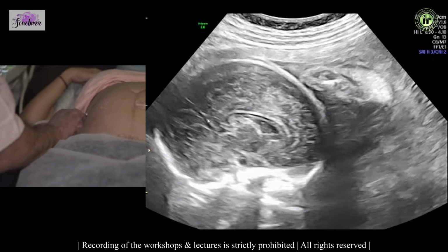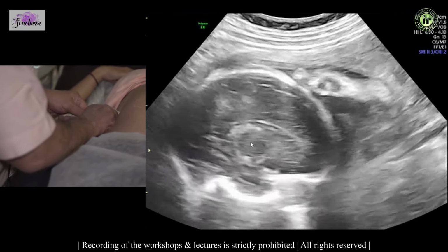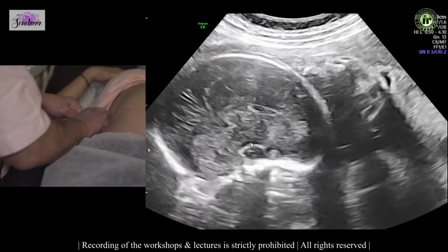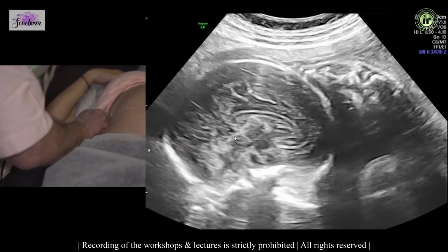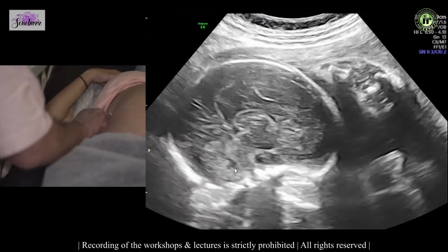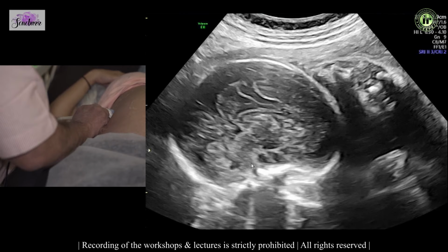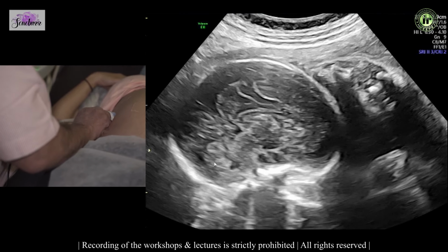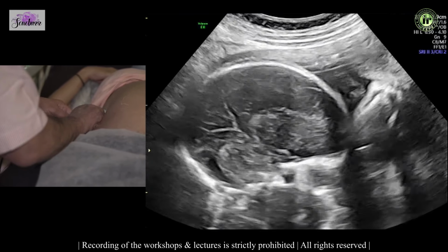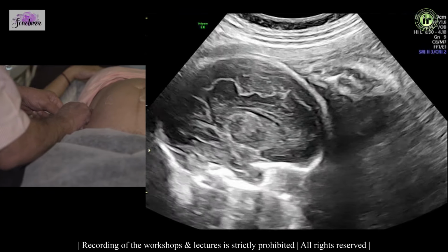This is the cavum septum pellucidum, the thalamus. That's the tectal plate, the midbrain, the pons, the fourth ventricle. This diamond-shaped structure is the fourth ventricle, the pons, the midbrain, the vermis, and this is the thalamus here. The massa intermedia.